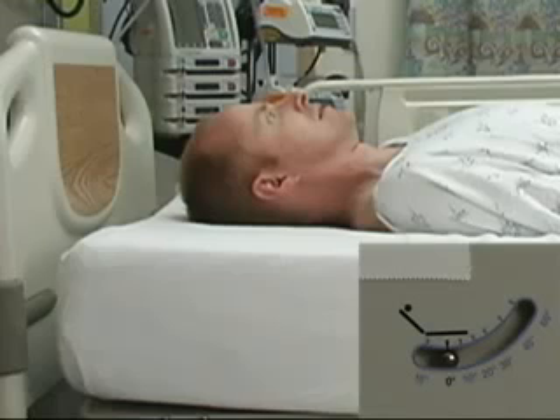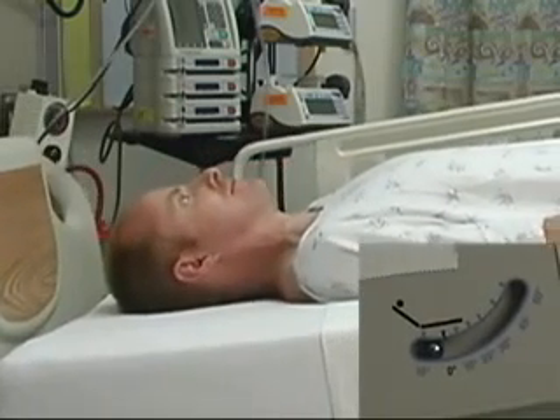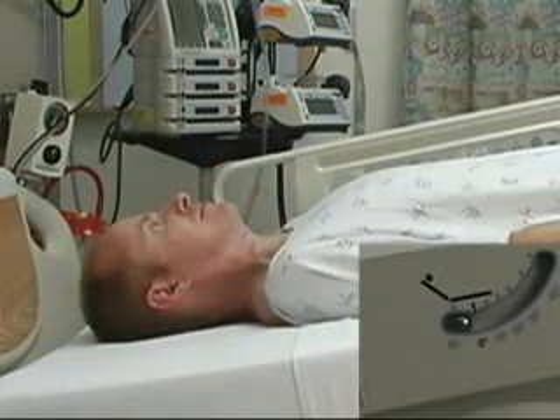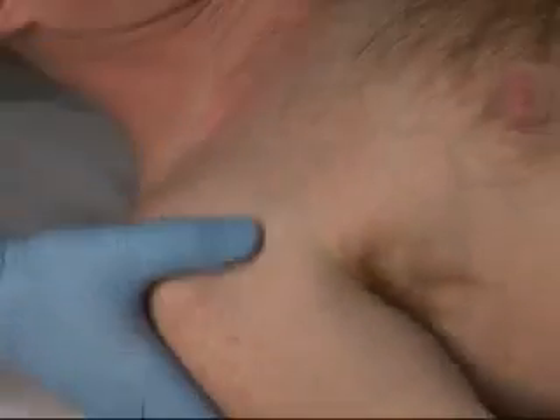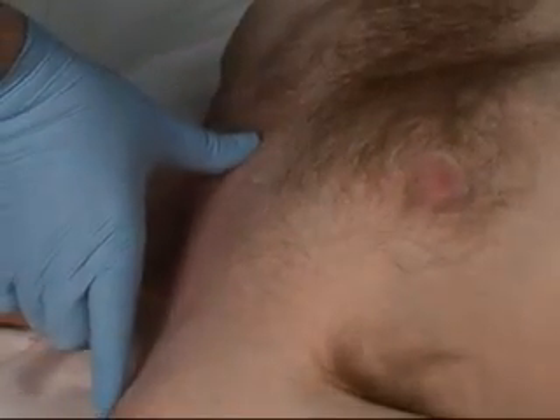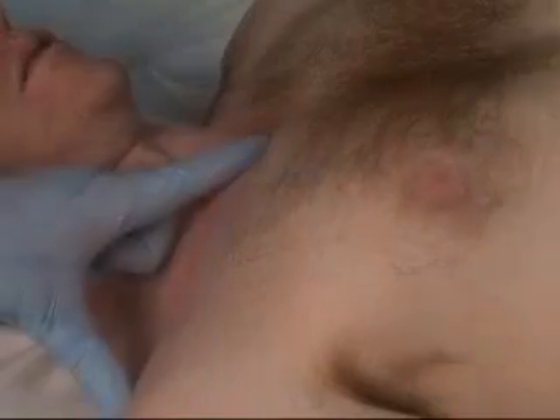If there are no contraindications, proceed by placing the bed in a 10 to 15 degree Trendelenburg position to decrease the risk of air embolism and to engorge the vein. Turn the patient's head so that the chin points away from the vein. A small roll can be placed under the spine to help make the clavicles more prominent. Identify the clavicle. The subclavian vein flows just under the middle third of the clavicle, while the artery runs posterior and superior to the vein.